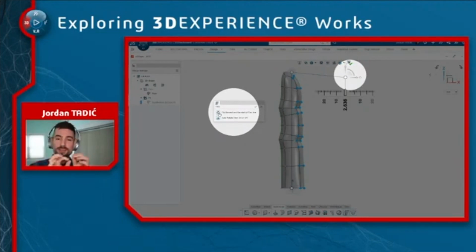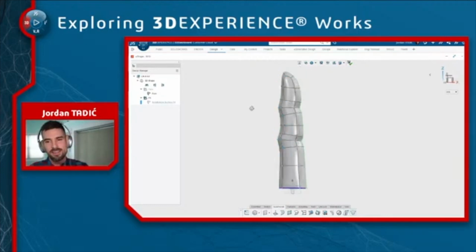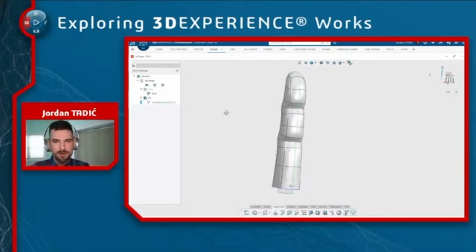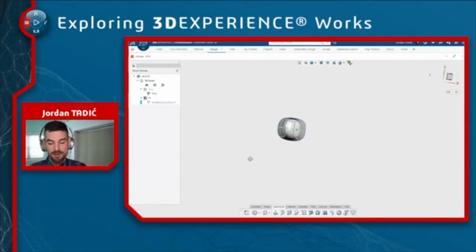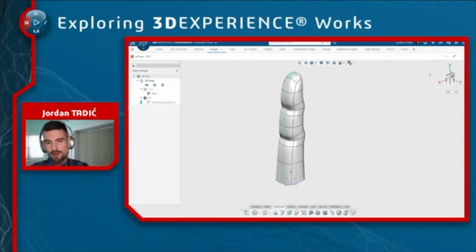Now, what if I wanted to drag the bottom outwards while keeping the top at the width that it was? I could just flip the side that the robot is attached to while maintaining that selection and drag outwards to taper the bottom outwards. So you could do this for the opposite side, the same effect. And again, it's the slightest details that we realized when designing this prosthetic hand that differentiate a mechanical, robotic looking finger from a lifelike one. And from the top view, we still have a ways to go because it's very much a squarish profile.